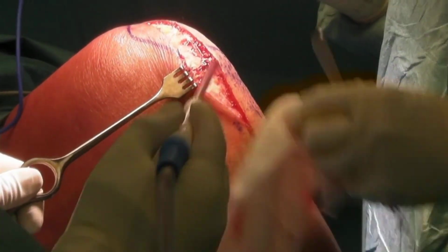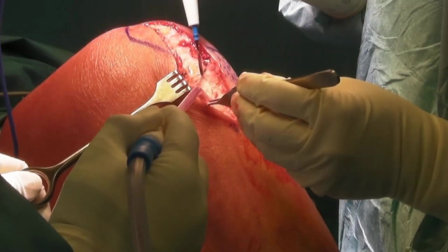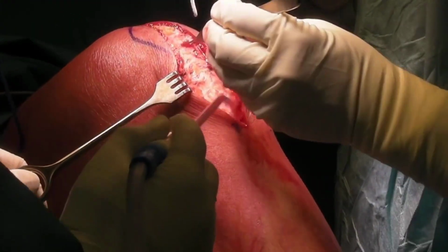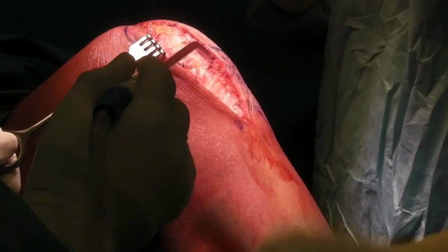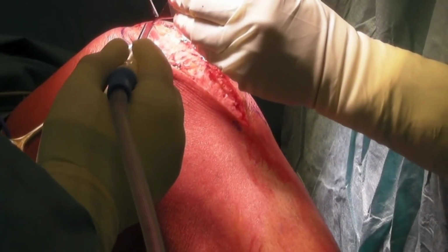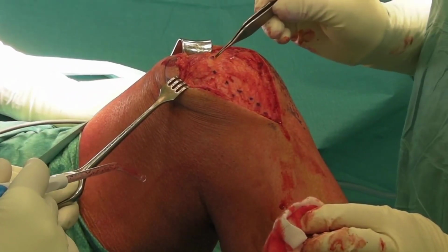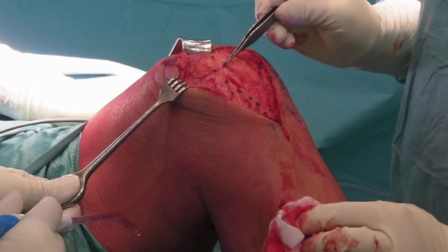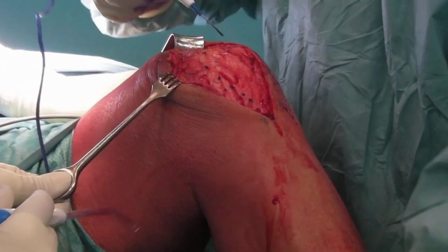Once the skin has been cut and the first hemostasis of the blood vessels has been performed, we go deeper, using an instrument that cuts and burns small arteries and veins at the same time. In a few steps, we reach the joint capsule.